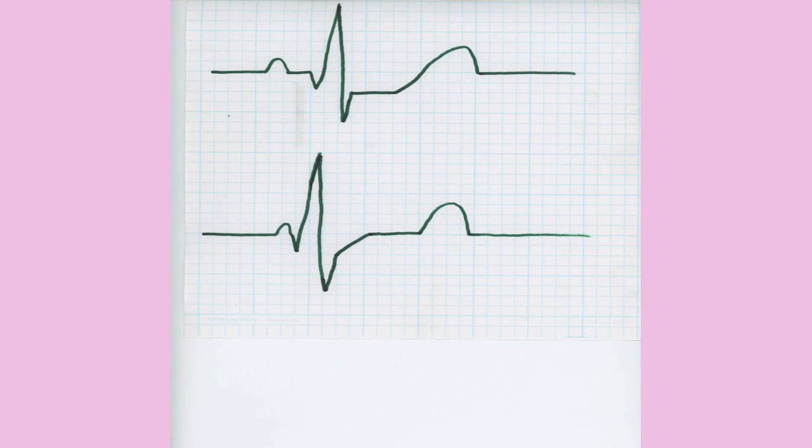If you go to the next slide, first off, you want to find the top line. There is no TA wave on this first one. So the top line is the isoelectric line where you can see the P wave, and then it goes into a flat area at the beginning of the Q wave, and you can also go way to the right of the T wave, and that's all the isoelectric line. That's your top line. Feel free, as we go through this, to pause or look back and forth at what we're looking for. Then the next step is to find the J point.